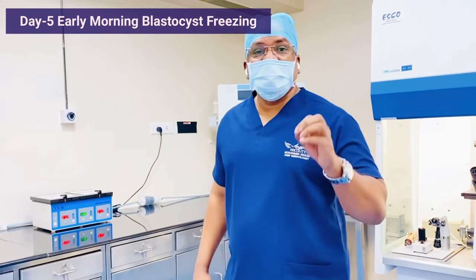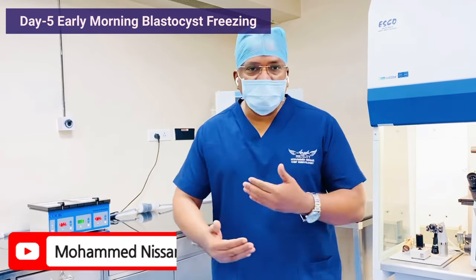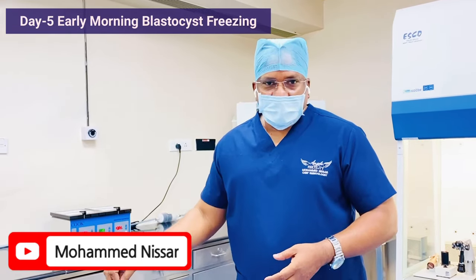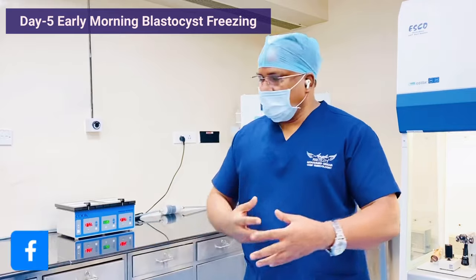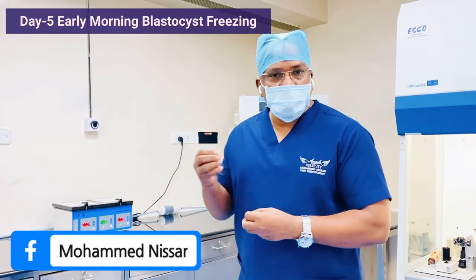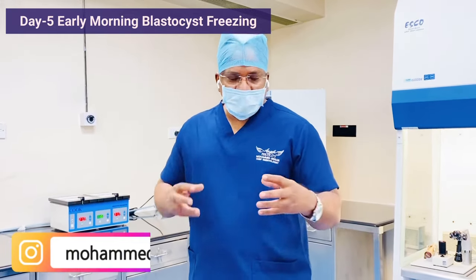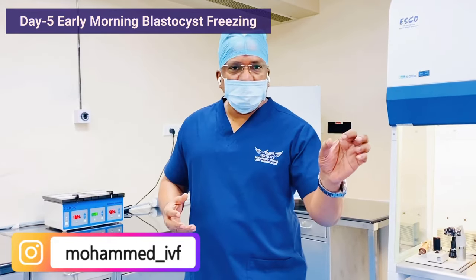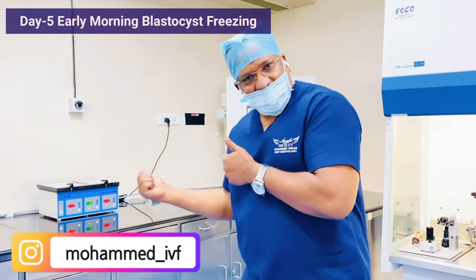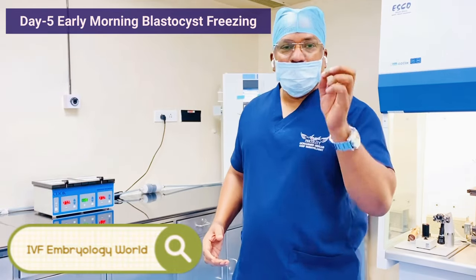And this husband has severe oligoasthenoteratozoospermia, and we are mostly performing non-donor work, so we don't have much option other than using their own biological sperm or eggs. The patient doesn't want any alternate arrangement, so we have only the option to use their own eggs and own sperm. And when you see the morphology, it is very poor. So my argument always is that bad-looking sperm can have good DNA, so they can give good embryos. This is the same case with the poor morphology of sperm, and still we got the best implantable blastocyst. Here we go.